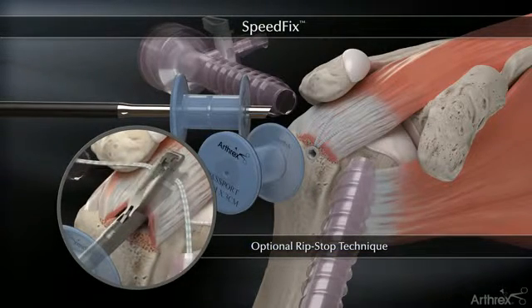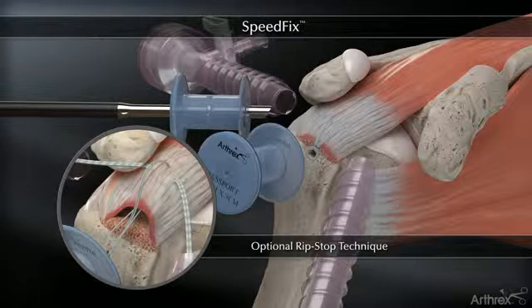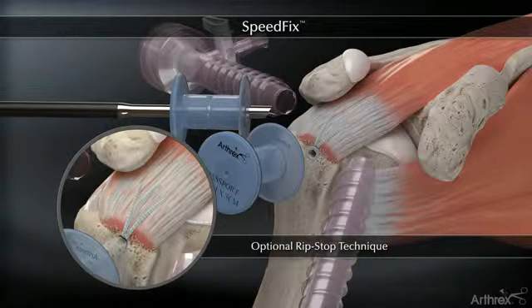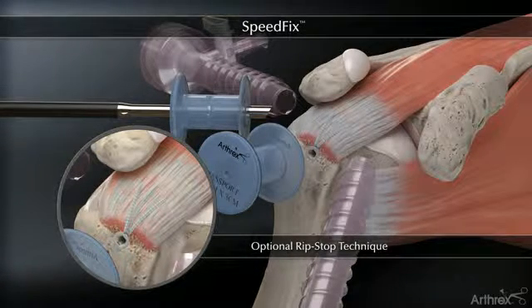Optionally, a fiber link cinch stitch can be passed medially to the fiber tape, creating a rip stop configuration to increase tissue pull-through strength. The cinch suture is incorporated with the fiber tapes in the swivel lock anchor, completing the knotless repair.